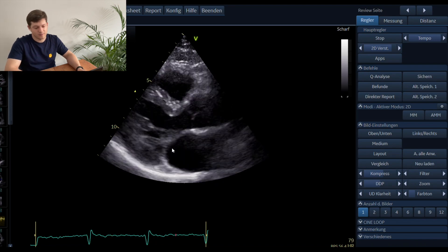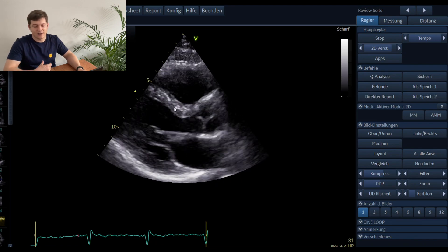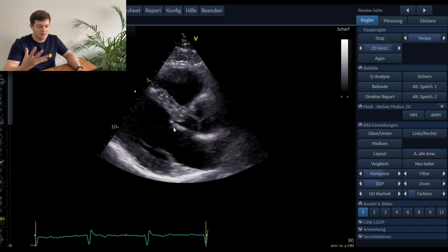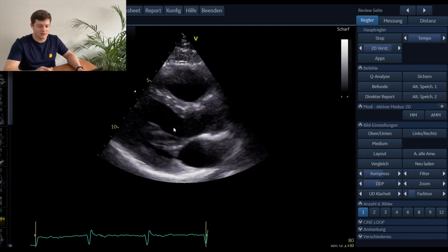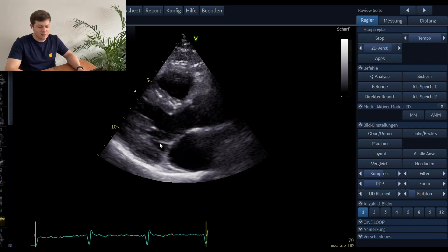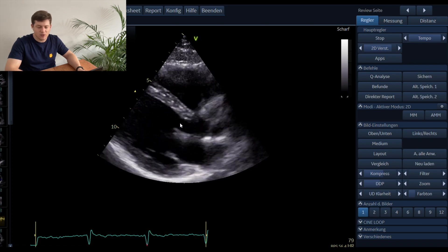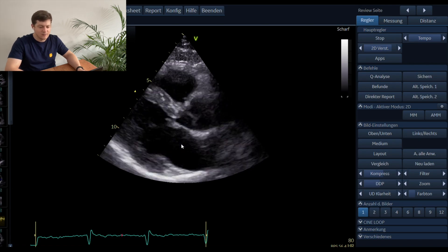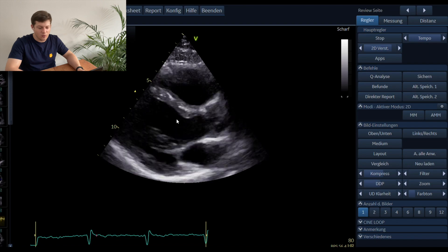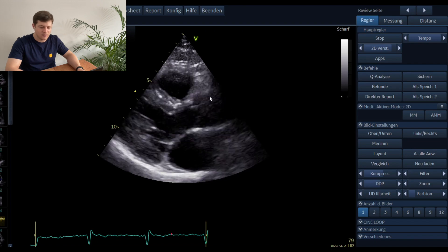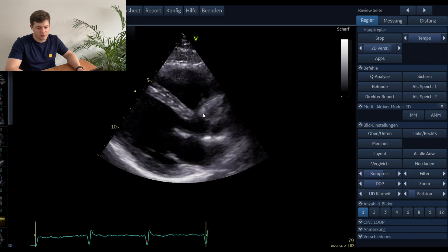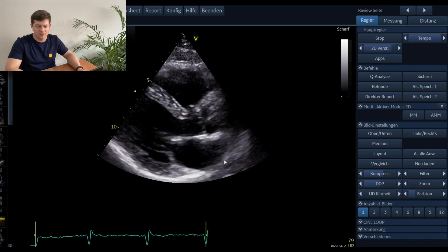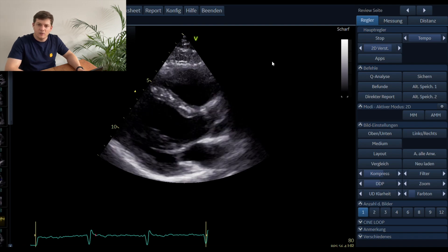You also see two very important valves and whether they are closing and opening properly. In this young healthy individual you can see how the mitral valve is opening and closing — there is no sign of premature closure of the mitral valve, so this is a normal valve. The same goes for the aortic valve: no abnormalities are seen in this view.